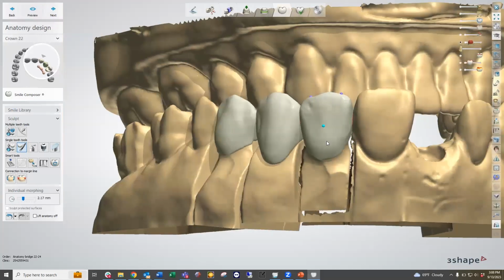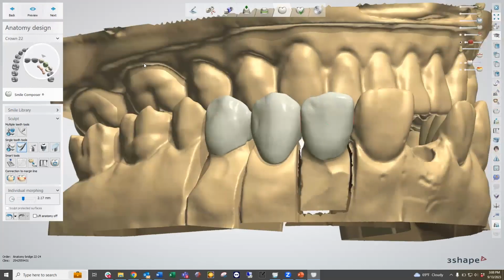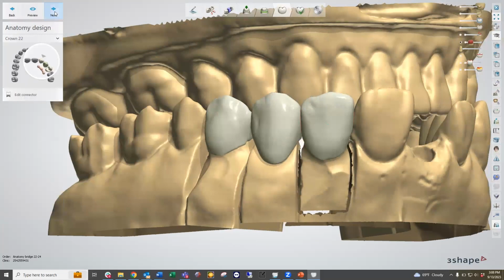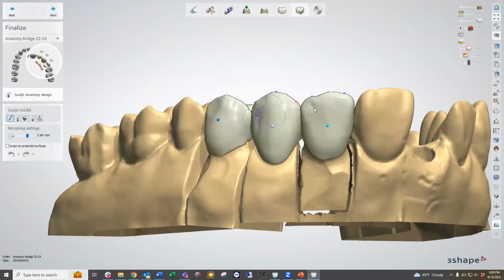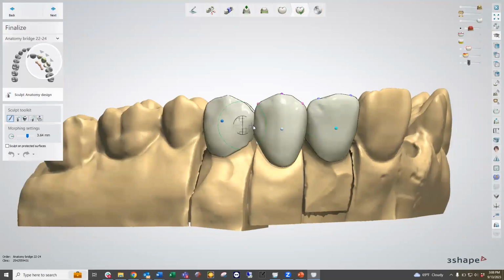We're going to go ahead and move on to the next stage, because right now we've treated these units as 3 individual units. The next stage combines them into one monolithic design, and this allows us to see if there's any issue with those pieces. Okay, so we're going to hit next. And now, rather than being 3 individual units, you can see that the gray is highlighting that whole bridge. So it's one monolithic structure.